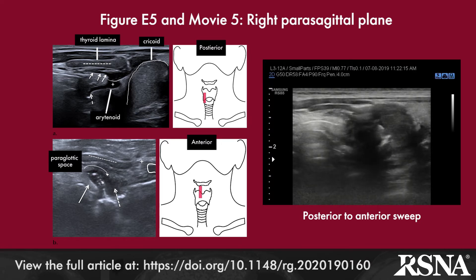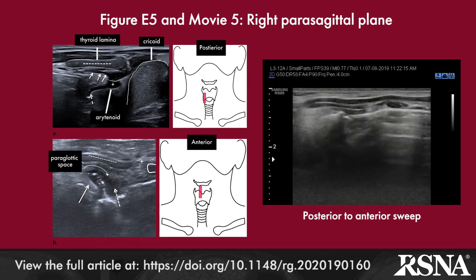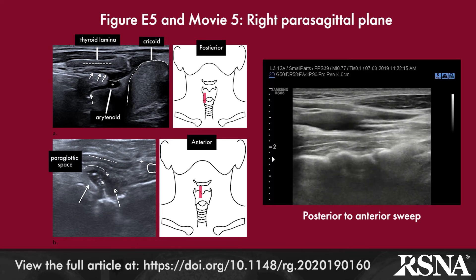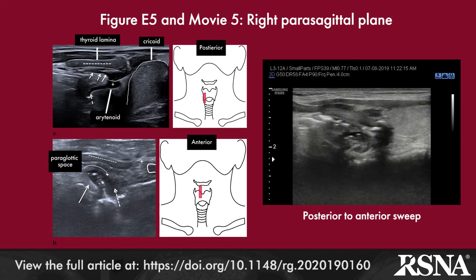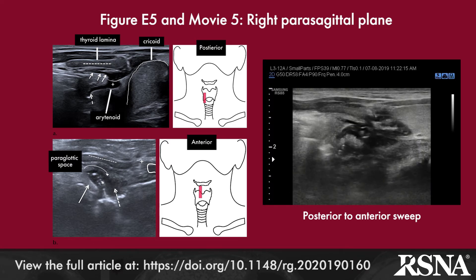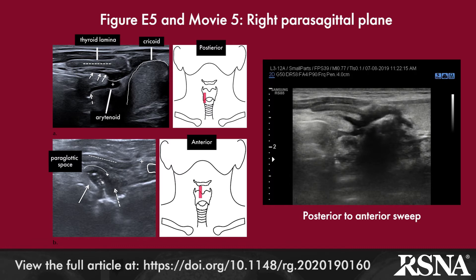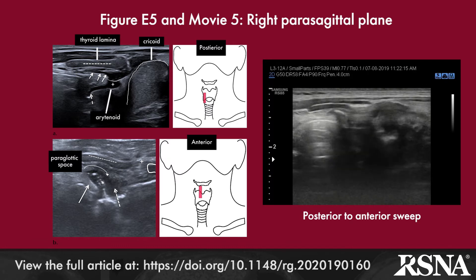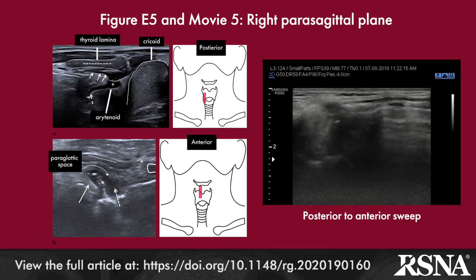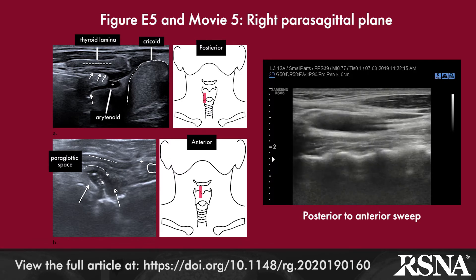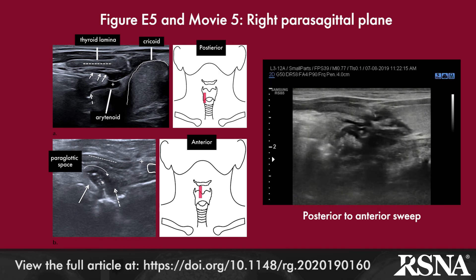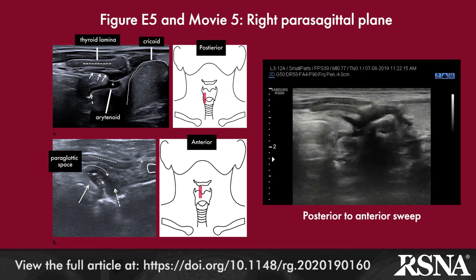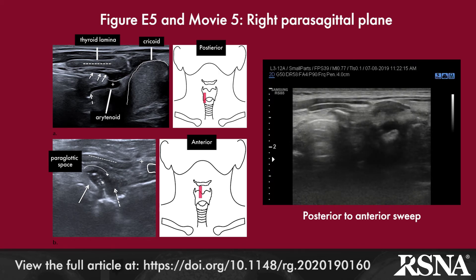An important anatomic landmark is the paraglottic space that extends between the ventricle and overlying thyroid lamina, which is a submucosal route for subglottic extension of glottic tumors, and is not visible at endoscopy.